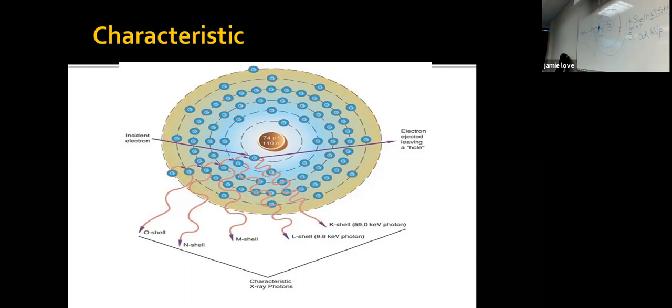So pretty much, the electrons come off the filament, hit the K-shell. If it's 70 kVp or above, then you have action. Now, is there a chance that that electron has 70 kVp and above and is just gonna pass right by and not hit an electron?